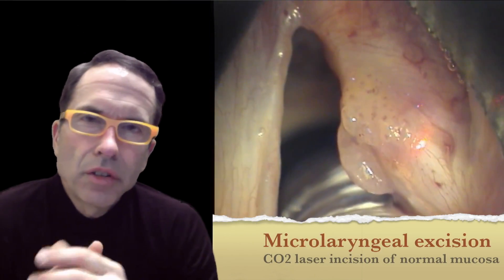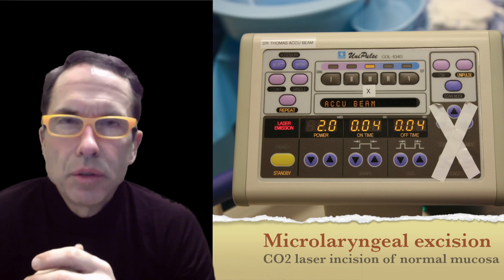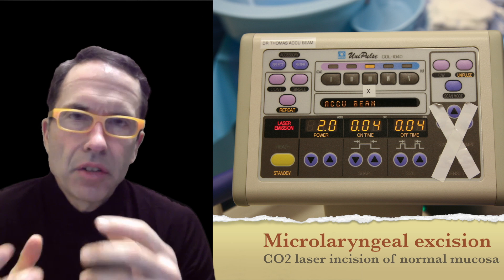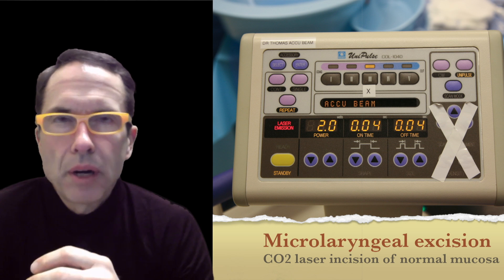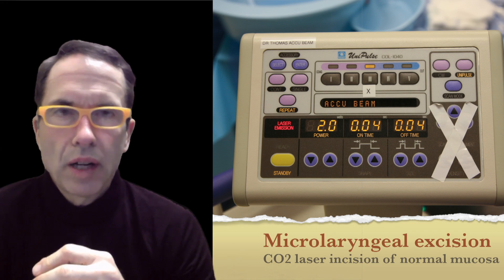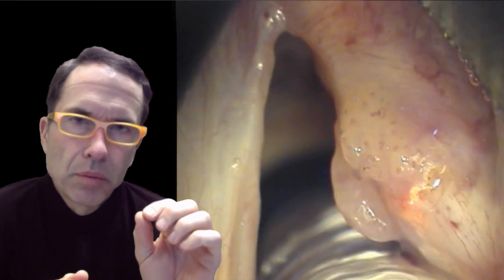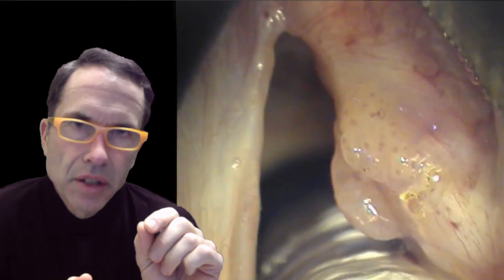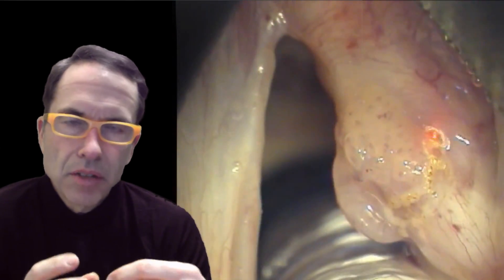Let's take a look at this excision. This is from about seven or eight years ago, with a unipulse laser — it's not programmable. I am using it on a super pulse mode at a very low power setting, perhaps about two watts. In this mode, it puts a large amount of energy in very briefly, which creates very little heat reaction — it ends up just cutting the tissue rather than burning it.